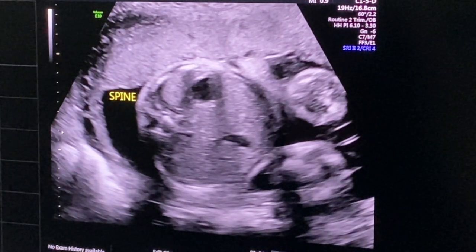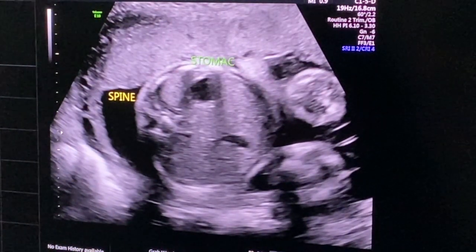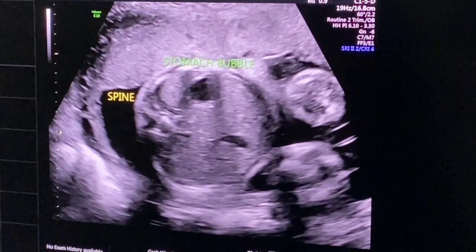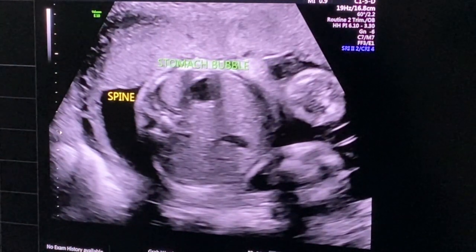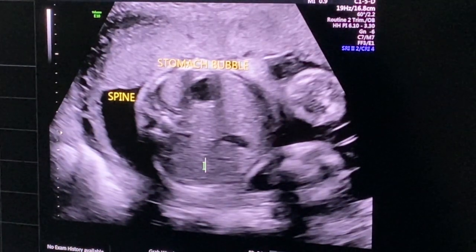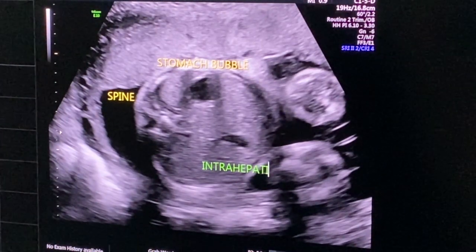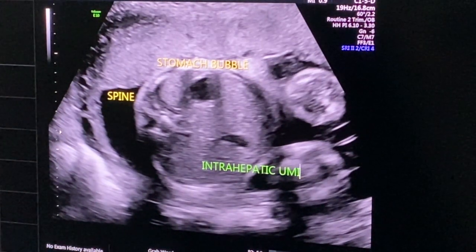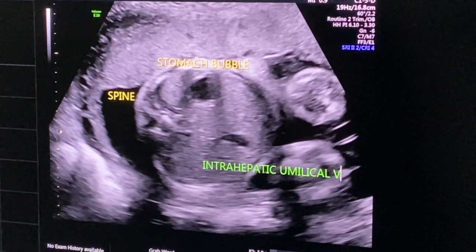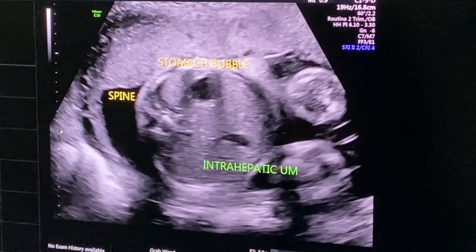The abdominal circumference is measured as a transverse section of the fetal upper abdomen. Landmarks include circular cross-section of abdomen, spine seen on cross-section, stomach bubble, intrahepatic portion of umbilical vein, and fetal ribs seen bilaterally in their entirety. The AC is best measured with the spine at 3 or 9 o'clock as it can cause shadowing in the 6 and 12 o'clock positions.